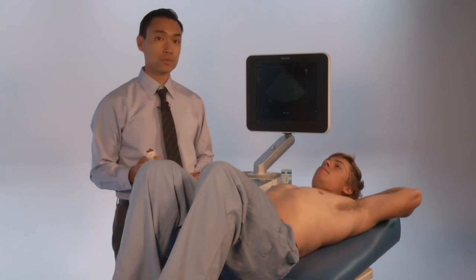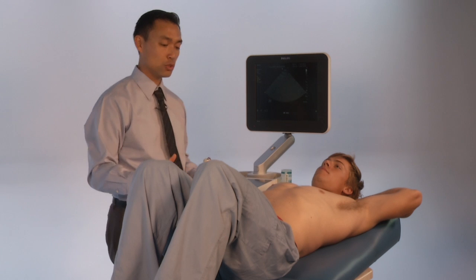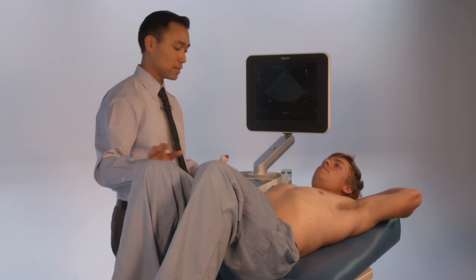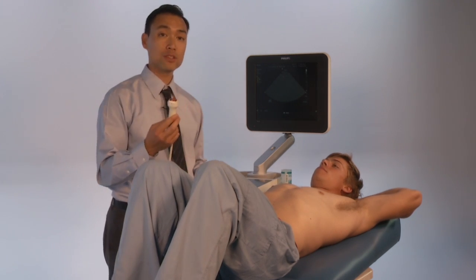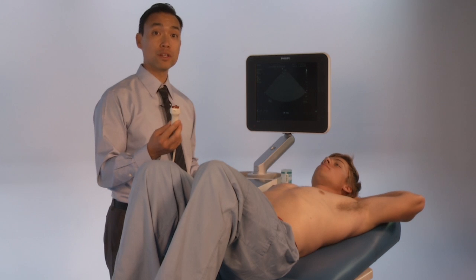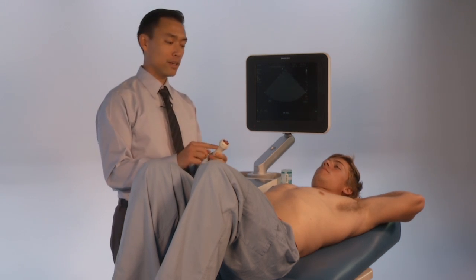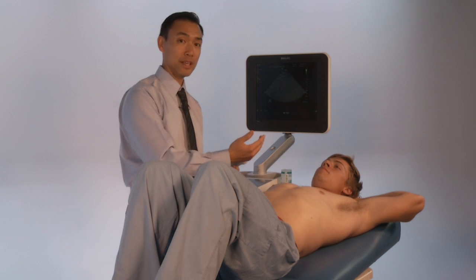We're going to evaluate the spleen using ultrasound. The patient is positioned in a supine position, with the legs flexed. You're going to be using a phased array or a curvilinear probe on abdominal setting, and the indicator is going to be pointing towards the patient's head.